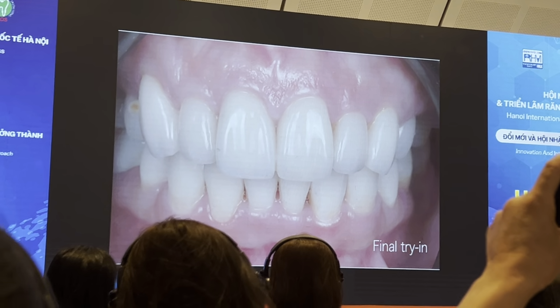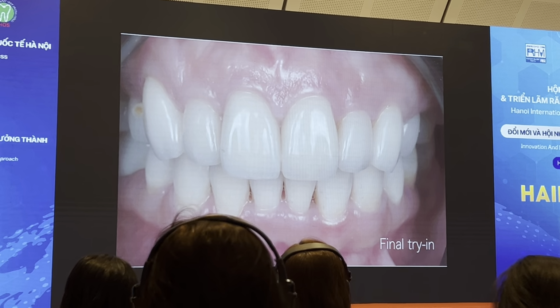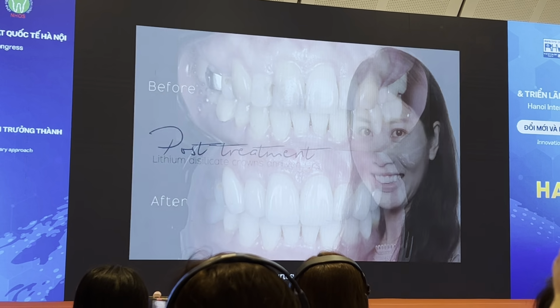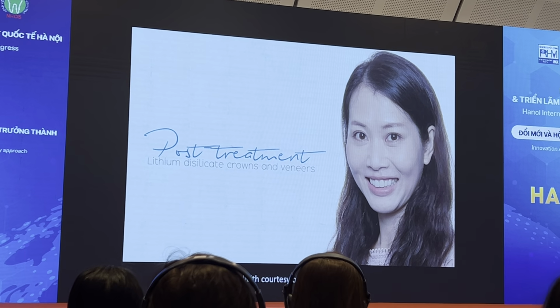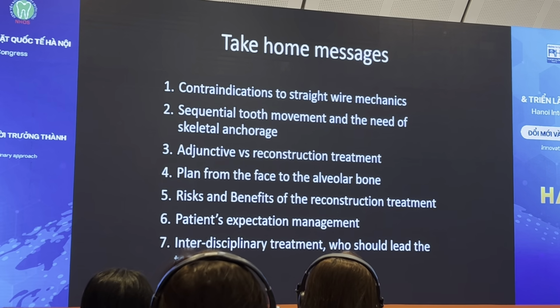This was the final form and inclination of the prosthesis. The lateral incisors were slightly retroclined. Before and after the restorative work, and we have a patient very happy after treatment. This is the end of the case presentation.